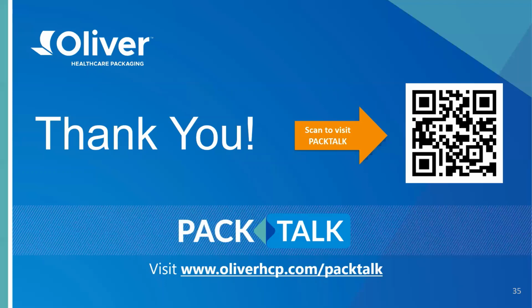And additionally, after that, the value that we usually get is some kind of arbitrarily selected value or number. It puts things in perspective when we're trying to go through the process with somebody. But in the spirit of ISO 11607, in talking about pouches, for example, the SPM and the MDM need to come together and agree on a value that's meaningful, yet doesn't discard or waste good sterile barrier systems. So that's part of the key as well.